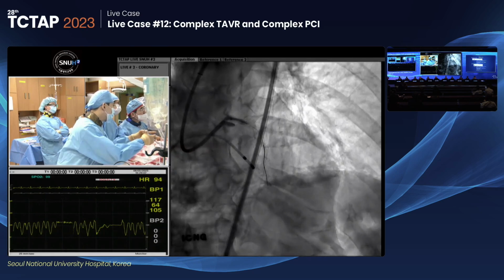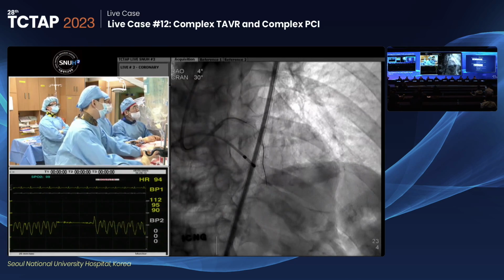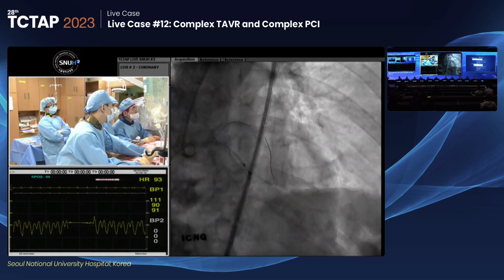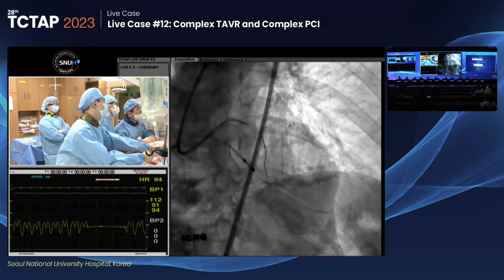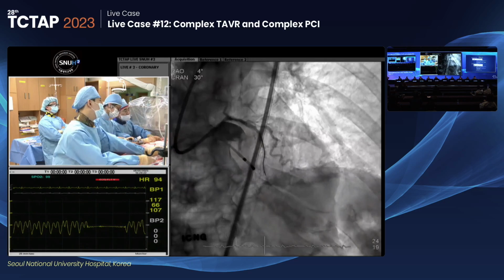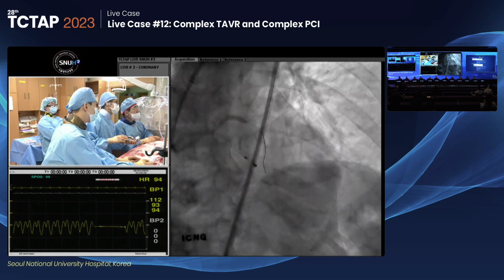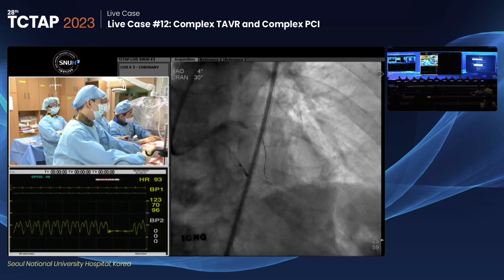Are you still using balloon pumps? Not much. Occasionally. You know, Impella is very expensive in the United States. Even though it reimburses, it's still expensive. Balloon pump is practically free. Inflation. Caudal deflation.